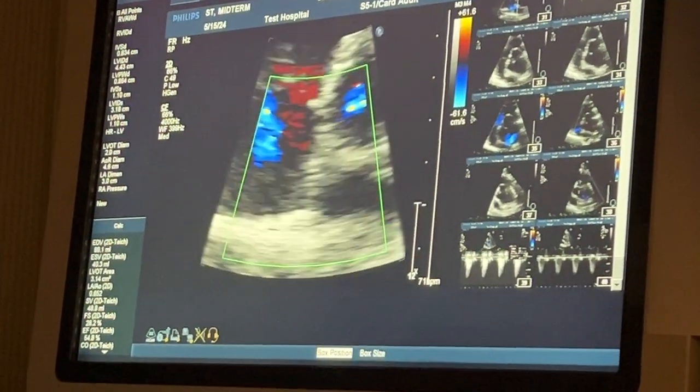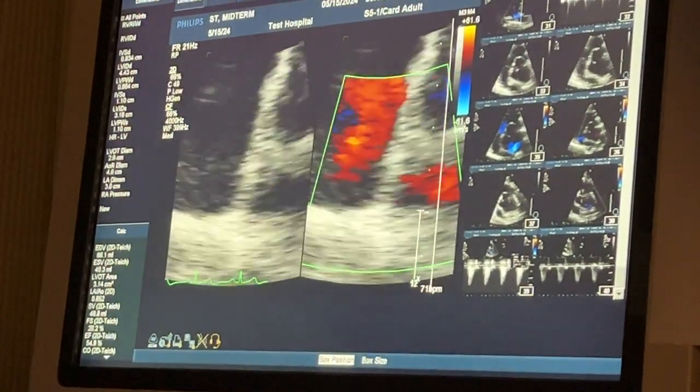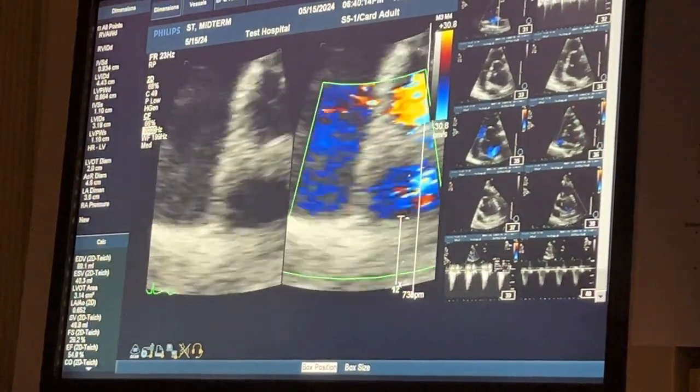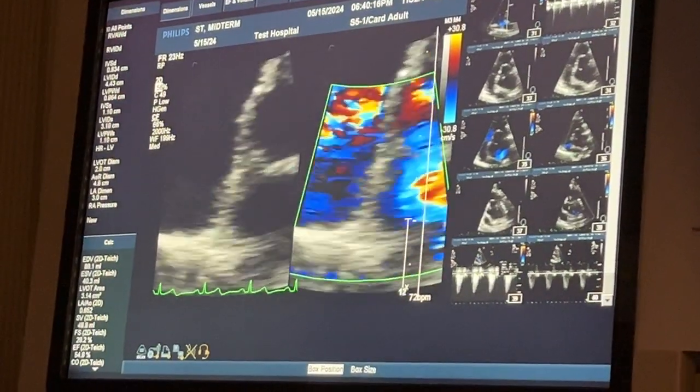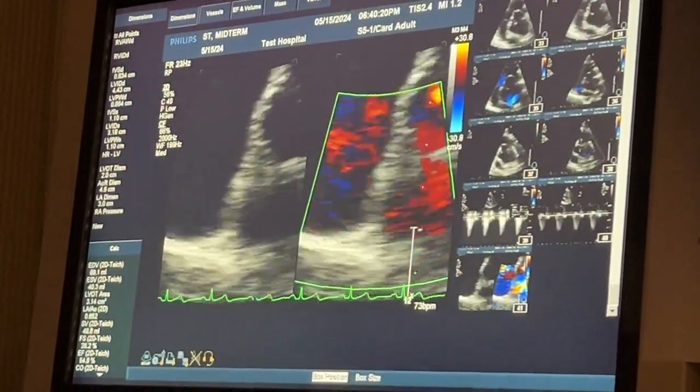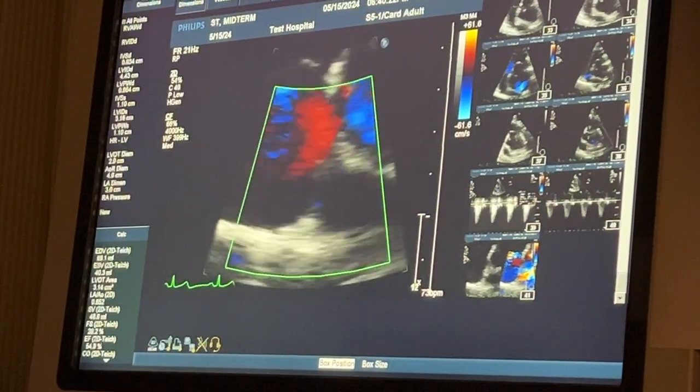Now, again, I really like color compare. If we don't have color compare, that's totally fine. You can just take two separate pictures, but turn your scale down to the 30s. Take a moving picture, and then return your scale to normal, and you can take color compare off.